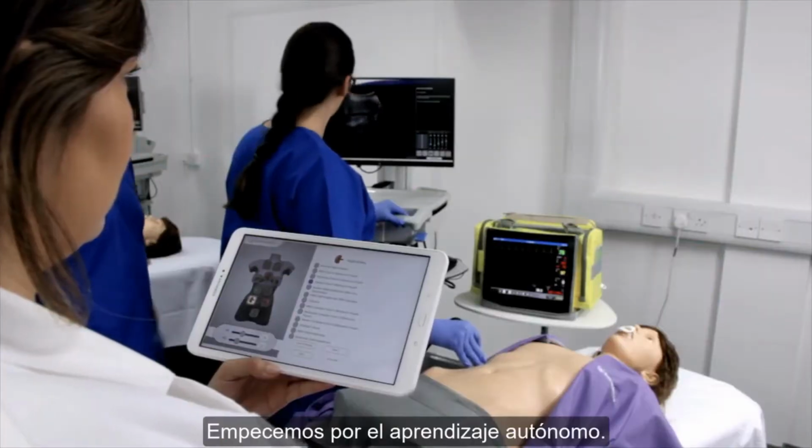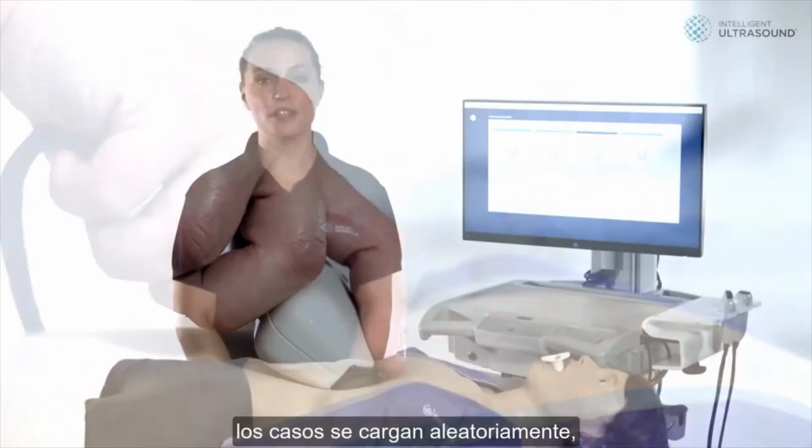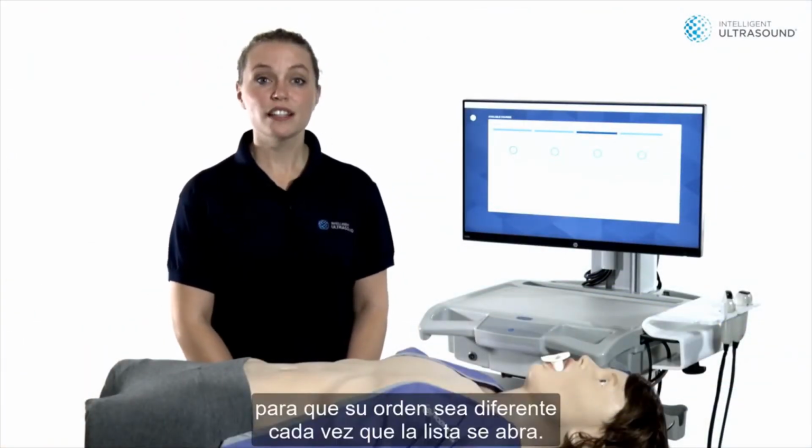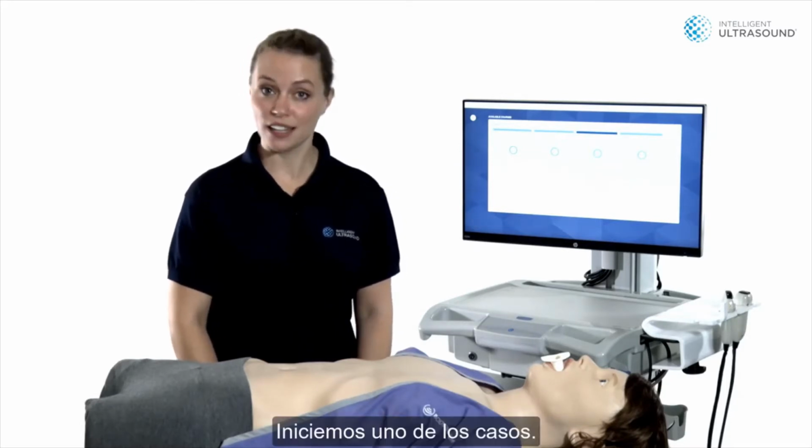Let's start with self-directed learning. In the patient lists, the cases load in a randomised order. This means the order of cases will be different every time the list is run. Let's run one of the cases.